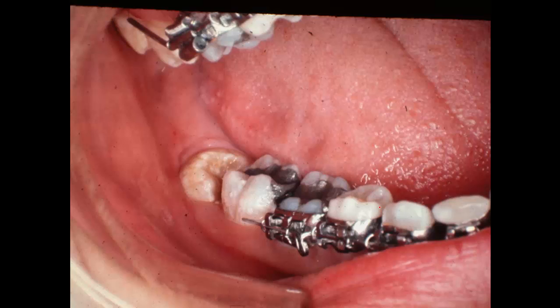And we'd removed a tooth in here, so I wanted to save this wisdom tooth. She's got plenty of room for it. And I knew I had to work from the side of it, but I didn't have anything that I could bond on there. But I could bond down in the occlusal surface of the tooth, so I etched, and the only bonding material I had was acrylic in powder and liquid form, and we could etch the surface of a tooth and take a little acrylic powder and liquid on the brush and go back and put it on the tooth and bond something to it.